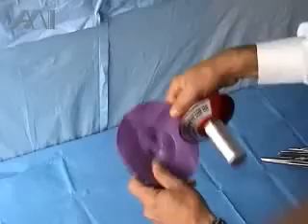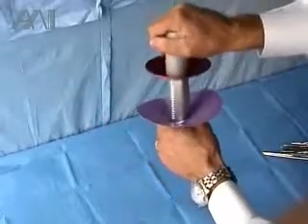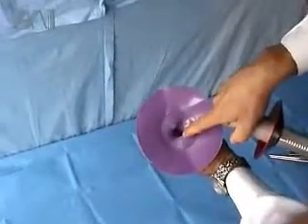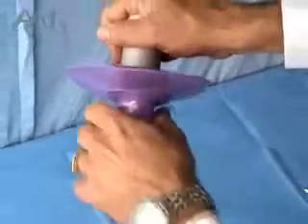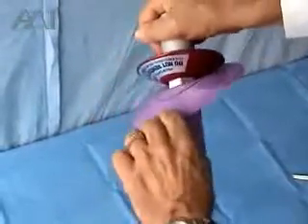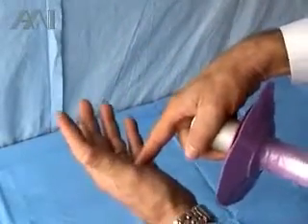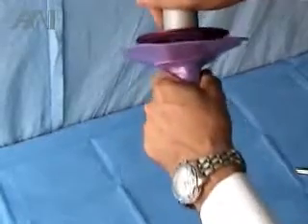This is also a better system than a competitive product which is very difficult to put on the light because of a constricting, reduced-diameter area. It is difficult to remove as well — you cannot peel it, and you need to grab it in the bloody area with a pinhole at the end of the procedure and try to squeeze it down, which is very difficult.